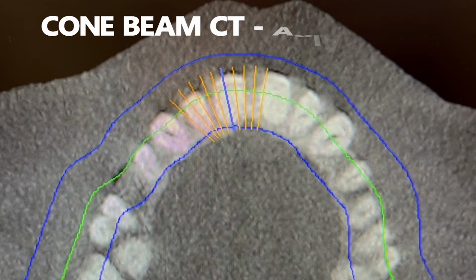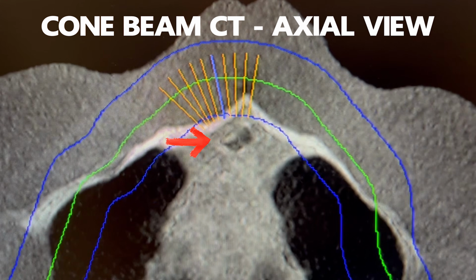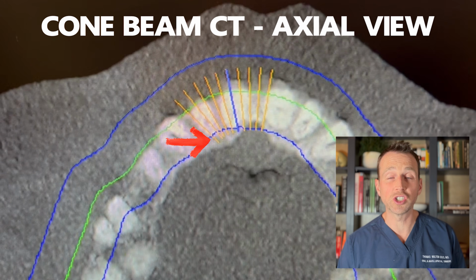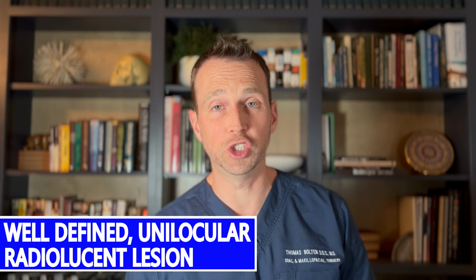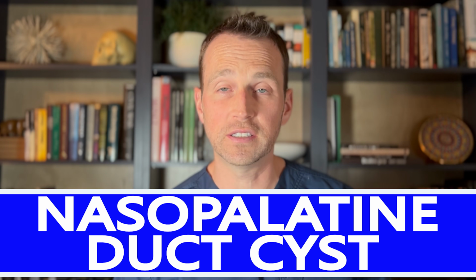I obtained a cone beam CT and there's a definite lesion in the anterior maxilla. This lesion is centered in the midline and does not appear to have any association with the tooth. It is a well-defined unilocular radiolucent lesion. This lesion has the clinical and radiographic appearance of a textbook nasopalatine duct cyst.